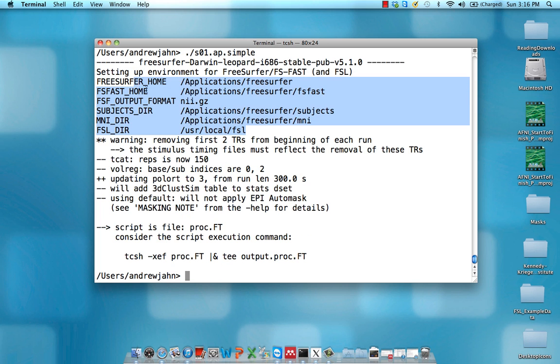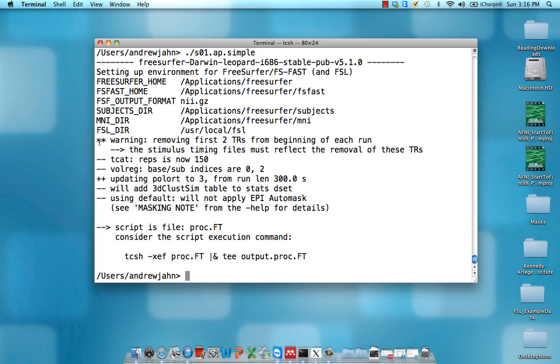Don't pay any attention to all of this, that's just my computer. But anything with two asterisks, that's usually an important warning that you might encounter some error, or you might need to pay extra close attention. First off, this warning means it's removing the first two TRs, like we specified in the command above, from the beginning of each run.